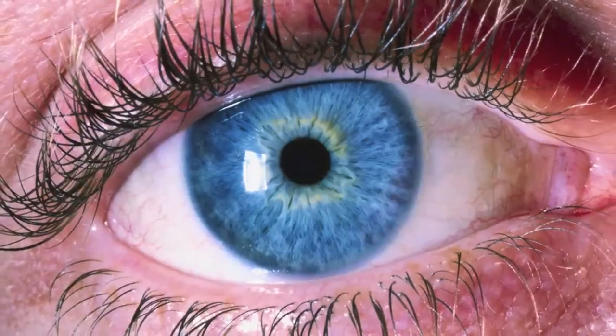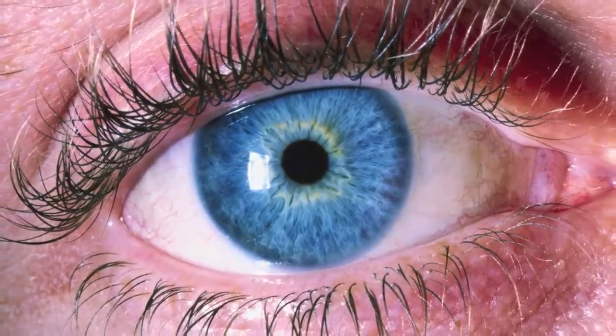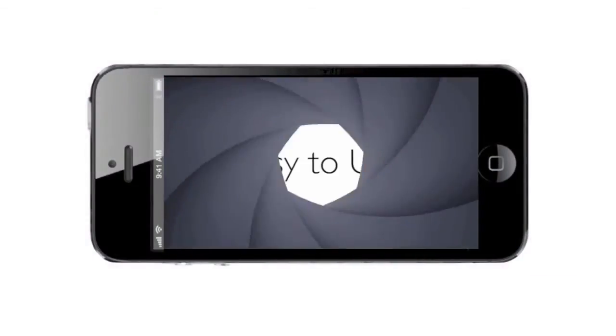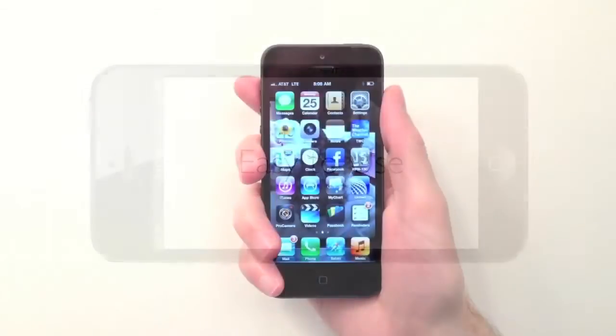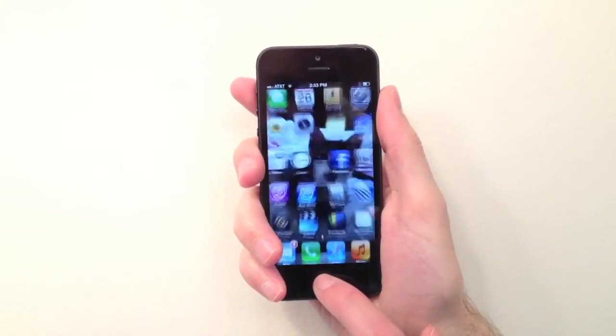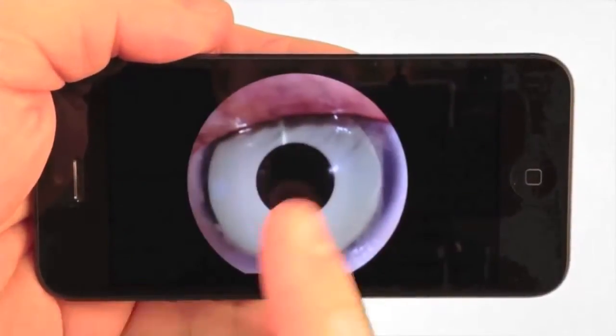Did you ever wish you had a better way to take photos or videos in the clinic or operating room? Something that was portable, easy to use, something that didn't cost a lot of money, and had great resolution. Wouldn't it be great if something like that was available? Well, it is.